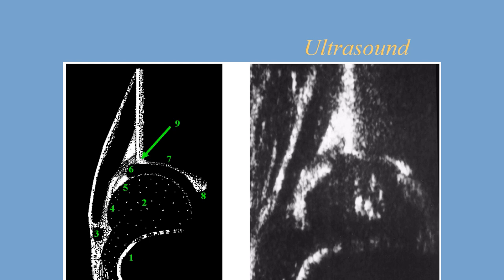In this normal hip ultrasound image with its diagrammatic representation, the 9 structures are as follows: the chondro-osseous border, which is the junction between the bony and cartilaginous parts of the femur; the femoral head; the synovial fold, which is the attachment of the capsule to the neck of the femur creating a fold; the joint capsule; the labrum, the triangular segment; the cartilaginous part of the roof, which will become ossified as the child gets older; the bony roof; the lower limb of the bony roof; the turning point; and the ilium.